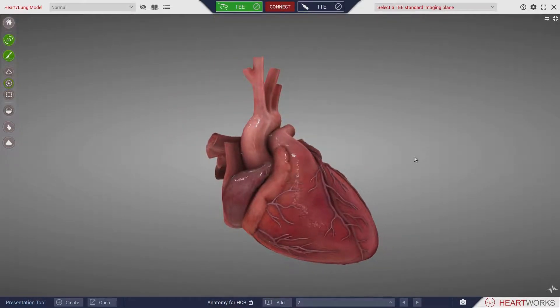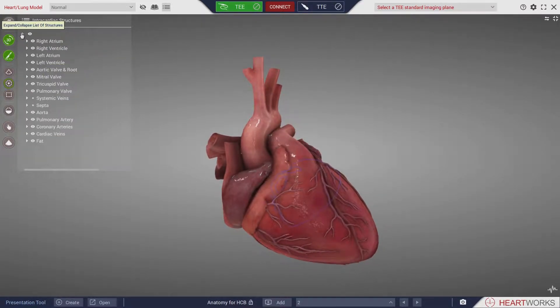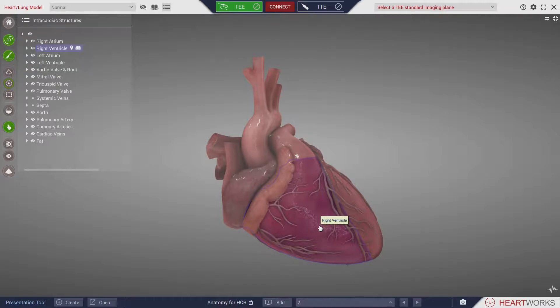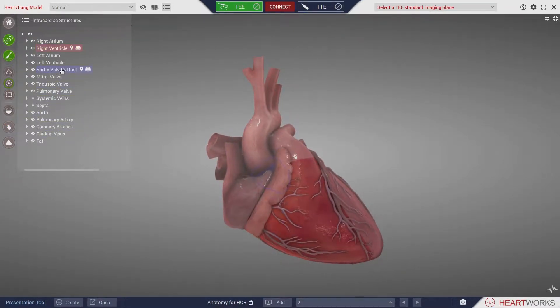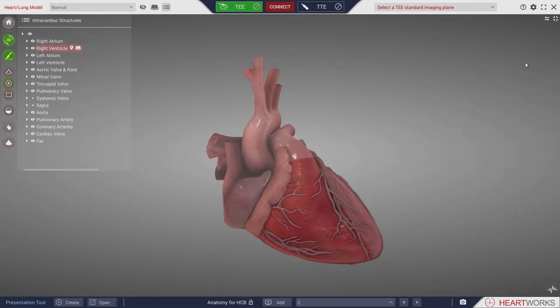The anatomy package includes an interactive textbook allowing the student to select one of over 130 separate structures within the model. Accompanying each structure are notes relating to the anatomy and echocardiographic imaging.